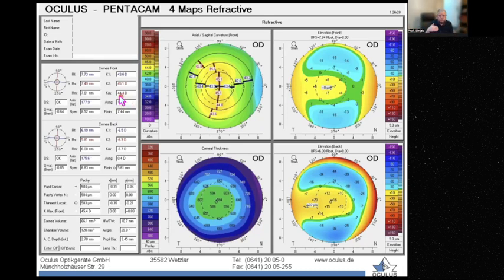But this is just to know your limit in the amount. For example, a patient coming with -8, and the K readings are 39. In this case, maybe you will end up with 34 and below, which is not good. So this is why we need the Km.